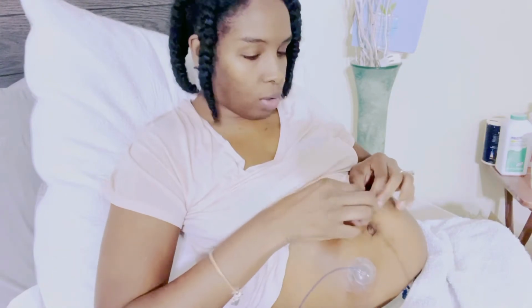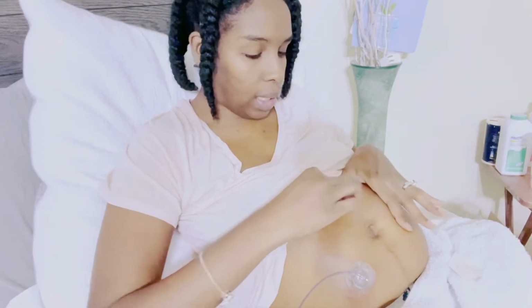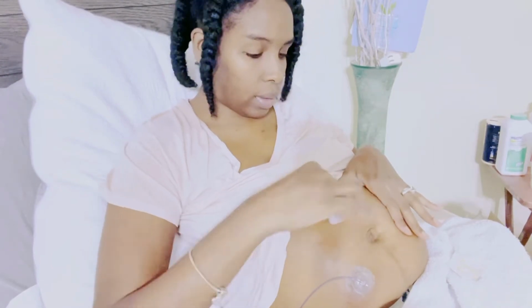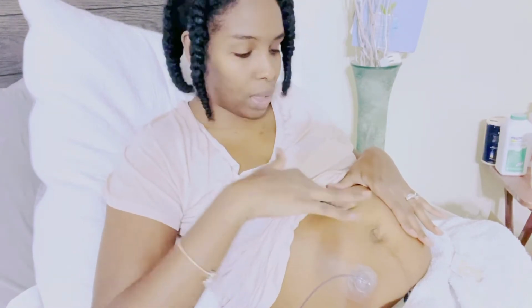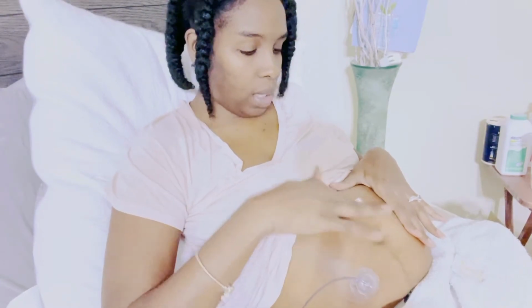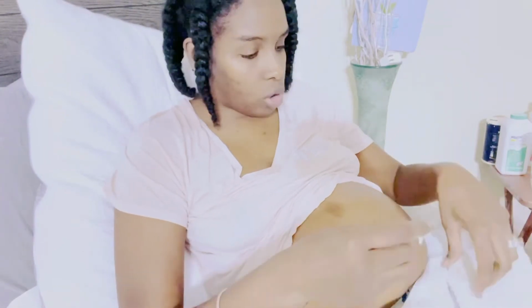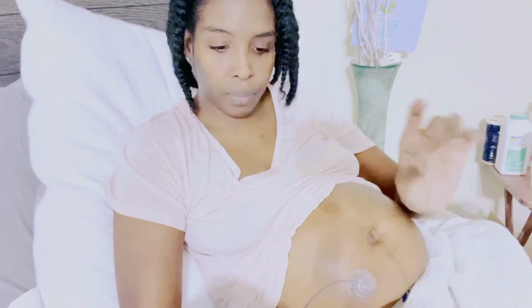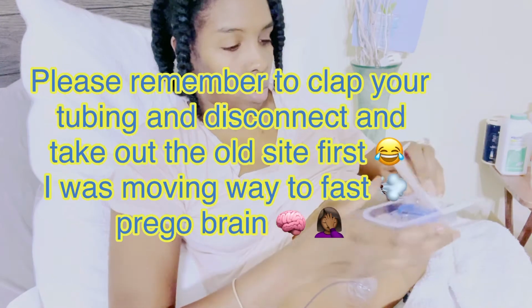Okay, so I'm going to go here because I haven't gone here yet. Let's clean this area. I just use baby oil on my belly. I'm trying to listen with my Doppler, but it's not really up here. I just got out of the tub, so I washed my hair and my body. And I like to keep all my trash together, nice and neat. Oh, this is going to hurt without my ice. Oh my God. So I open this up.